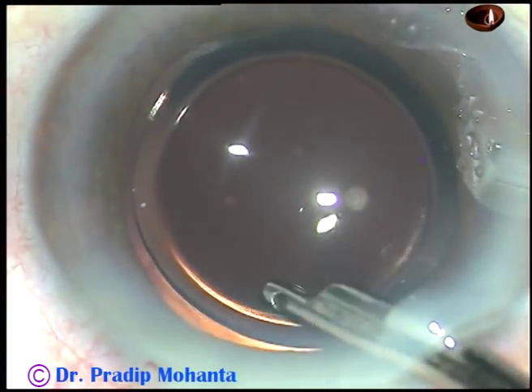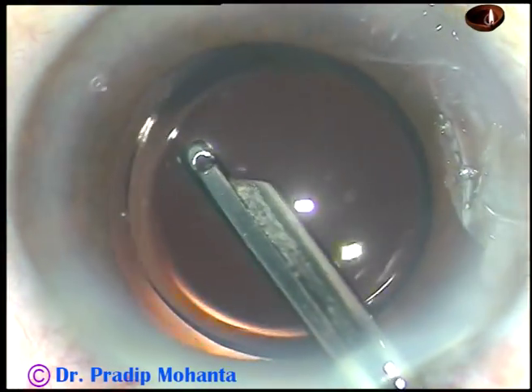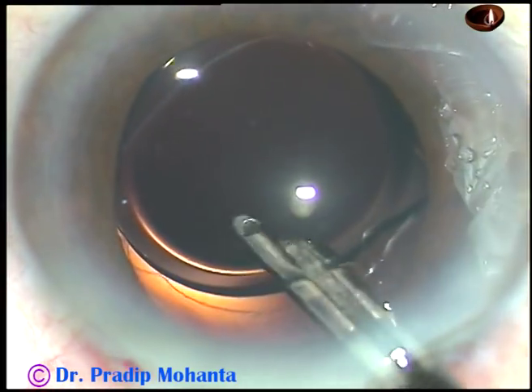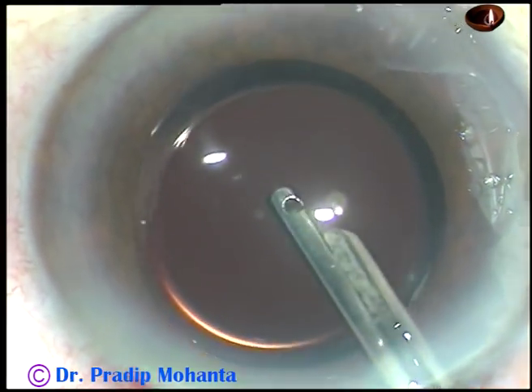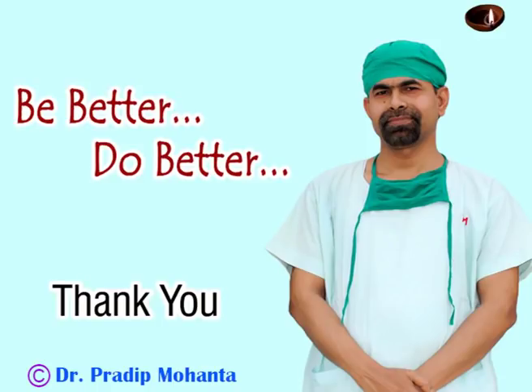Now the side ports are hydrated and this is the final lavage of the anterior chamber. I find that I cannot rotate the IOL clockwise, surprisingly, but I can rotate the IOL anticlockwise. Going behind the lens — this is the final lavage of the anterior chamber. I form the anterior chamber nicely and conclude the case. Thank you very much for watching. Hope this video will give you essential tips to manage cataracts with very shallow anterior chambers. Dear colleagues, we must improve our surgical skills and give very good service to mankind.